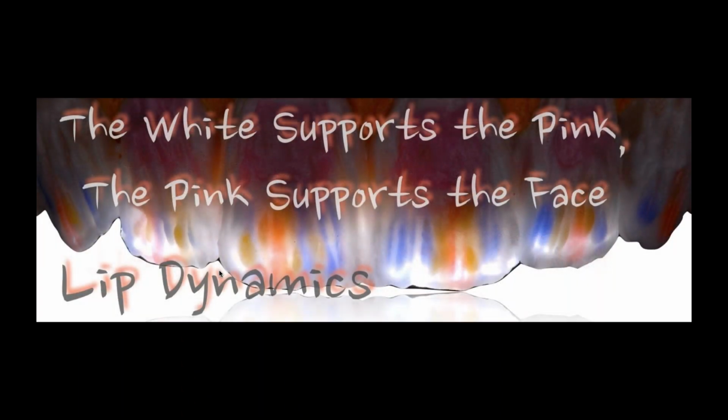Okay. The other part of this is as I work my way through the cases, I'm going to separate out the color now and think more about the actual tooth position. I always say that the white supports the pink. So the tooth supports the gingival architecture, and then the pink supports the face, the lip support, and the dynamics of what we see in the face.